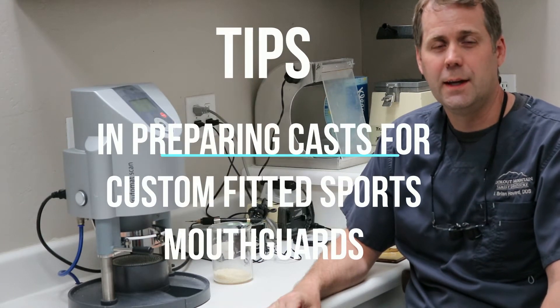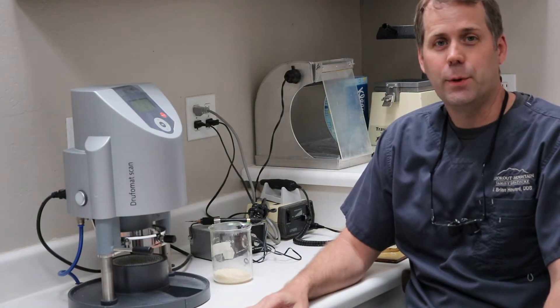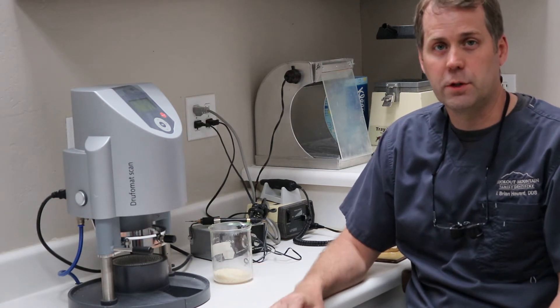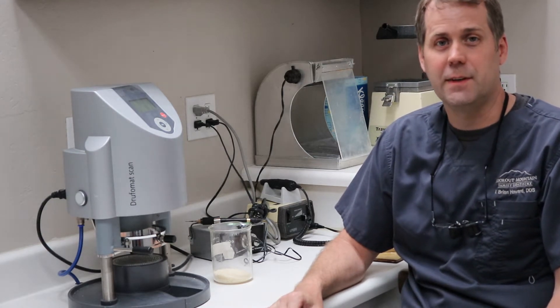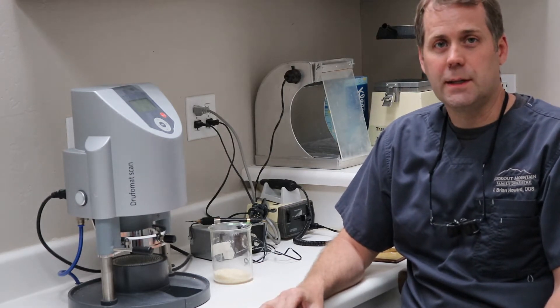Hello again, Dr. Howard here in our Dental Lab at Lookout Mountain Family Dentistry. Welcome back, we're glad to have you. We've got a special video today to give you a pointer, a real good tip that I found to be very helpful in making some of these mouth guards — these sports custom fitted mouth guards that we make.